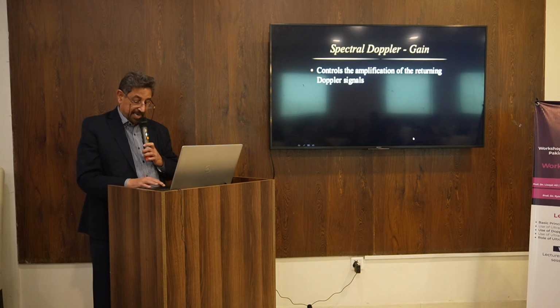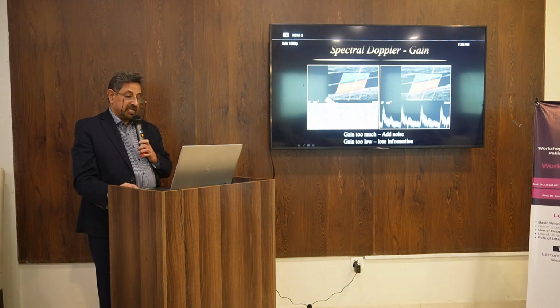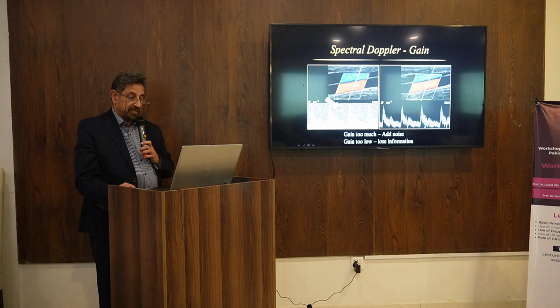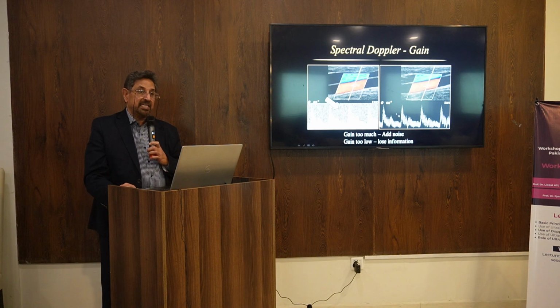Gain, we discussed that as in ultrasound there are gains. In the same manner, there are Doppler gains. If you increase the Doppler gain very high, you can't see this nice spectrum, and this is very high gain. You do so many things in that, and you can't diagnose. You have to bring the gains down in a proper manner. If your gains are too low, the spectrum will be eaten up. You will lose the spectrum.